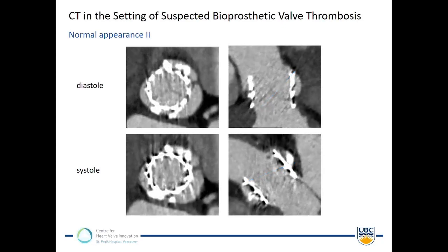Again, in diastole, you can see the leaflets a little bit more faint. In systole, no leaflets visualized, maybe due to the temporal resolution of the scanner, maybe due to the beam hardening artifacts. And important, when you're looking at artifacts, they are always in line with the direction of data acquisition. So pretty much it's perpendicular to the z-axis of the patient. That's important then when interpreting those streaks.